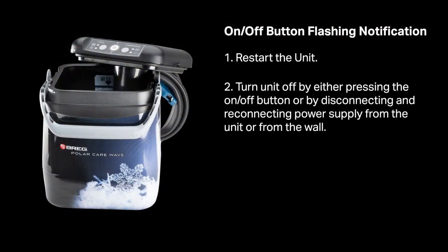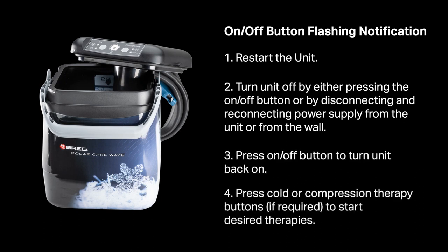Turn the unit off by either pressing the on-off button or by disconnecting and reconnecting the power supply from both the unit and the wall. Press the on-off button to turn the unit back on. Press cold or compression therapy buttons, if required, to start the desired therapies.